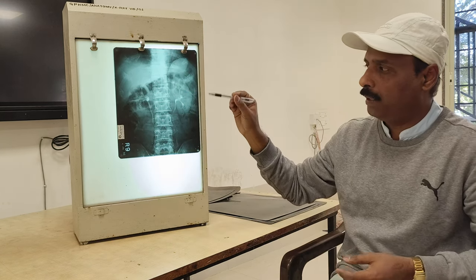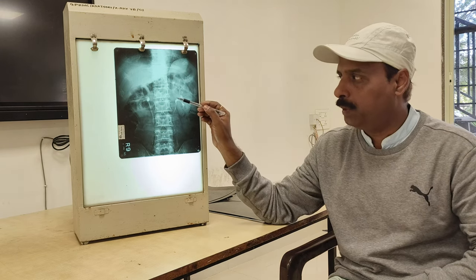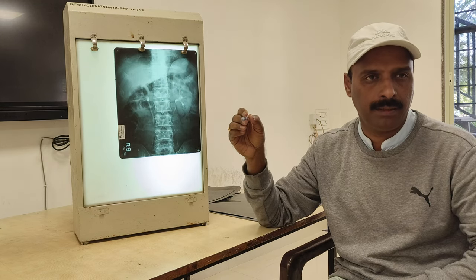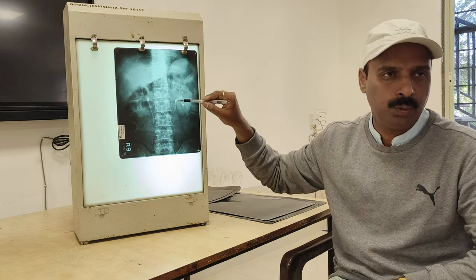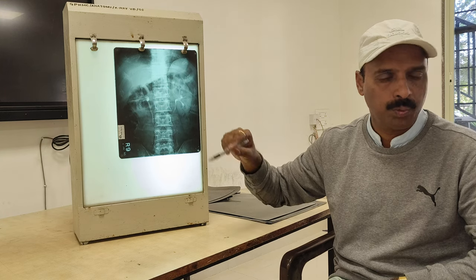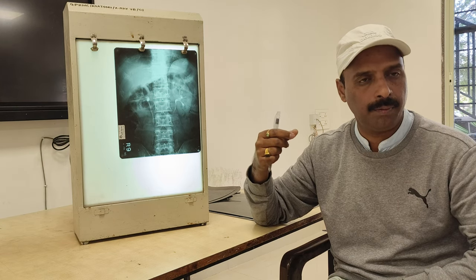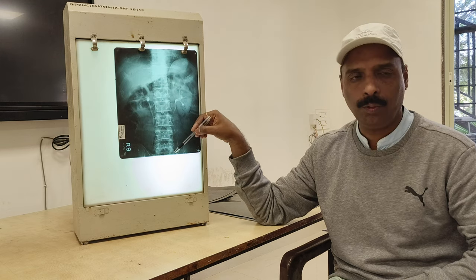This x-ray is intravenous pyelography, IVP. The person is injected with the dye in the blood, an iodine product given by intravenous injection. It goes through the blood and reaches the kidney. Then the kidney starts filtering, so it is excreted through the kidney to the ureter and urinary bladder as urine. During that time we take the x-ray. We call it intravenous pyelography because we have to highlight the kidney, ureter, urinary bladder.